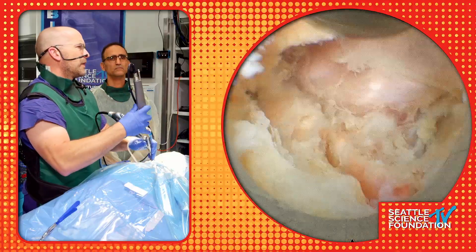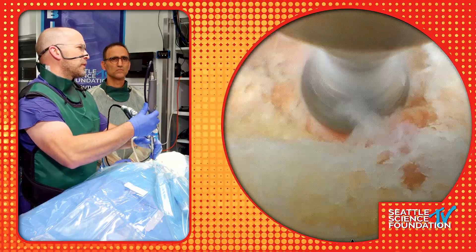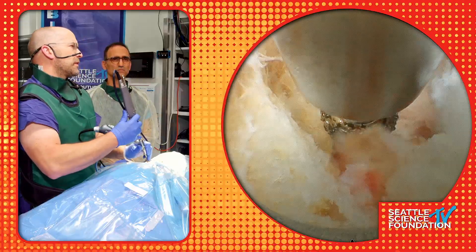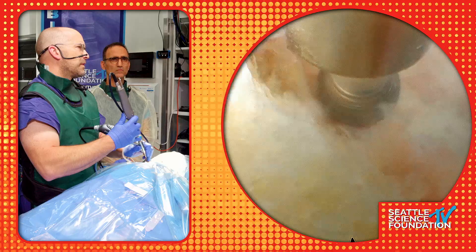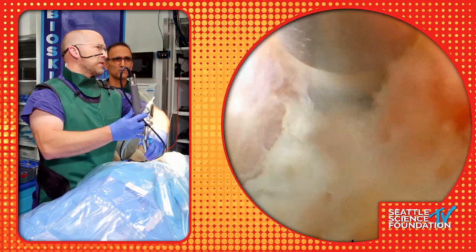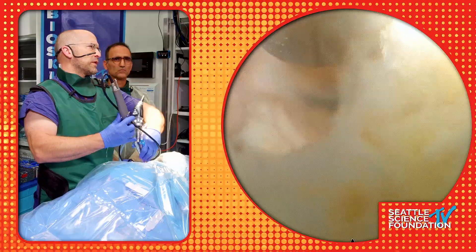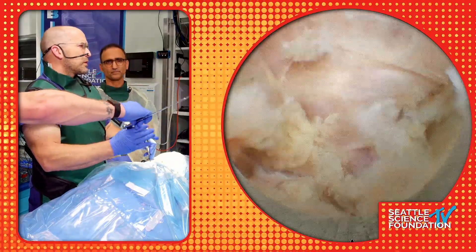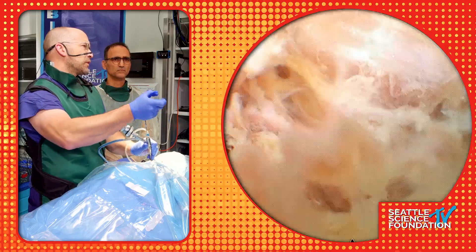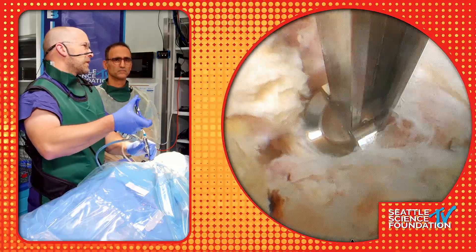We drill this down — here's the IAP from C4 coming down. Now knowing where the nerve root is, we drill a little bit more. The nice thing about the diamond drill is you can roll it over the edges, then take your tubular retractor to pull it back, looking upwards and sidewards to expose the entire exiting nerve root. The harder thing about these cervical cases is endoscope control — in the lumbar spine you don't move the endoscope as much; in the cervical spine there's much more moving around.